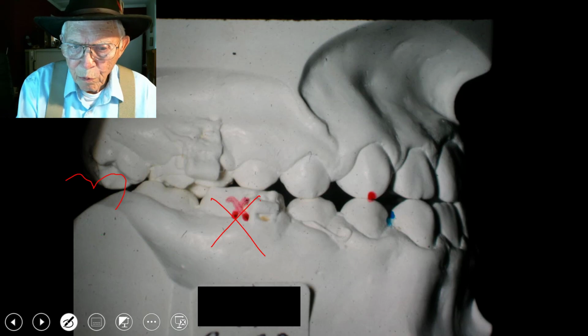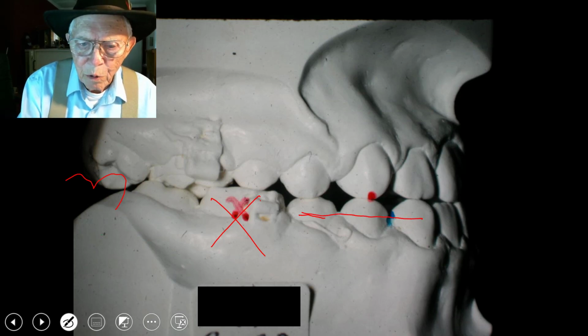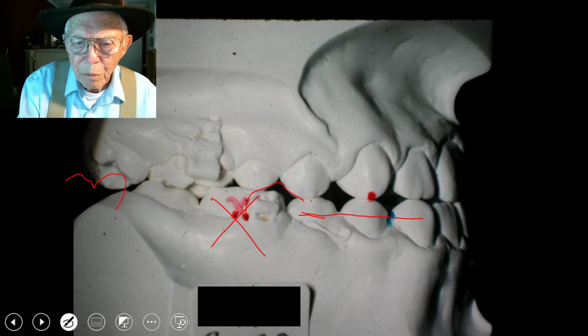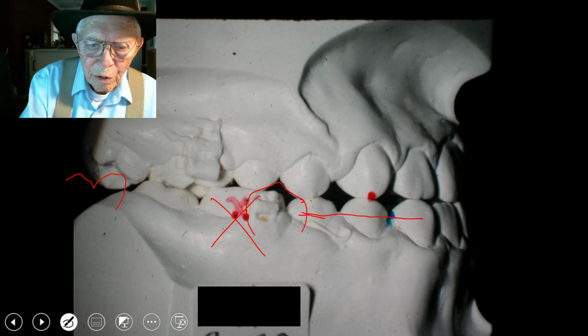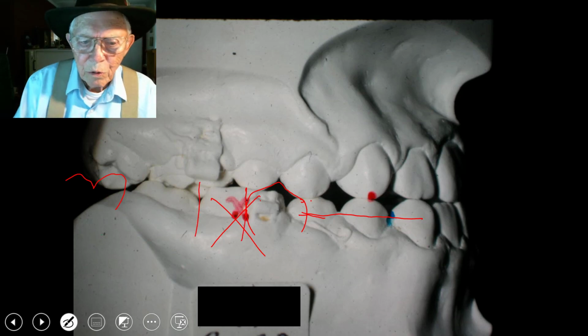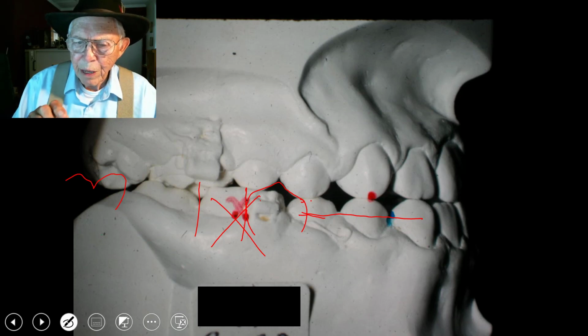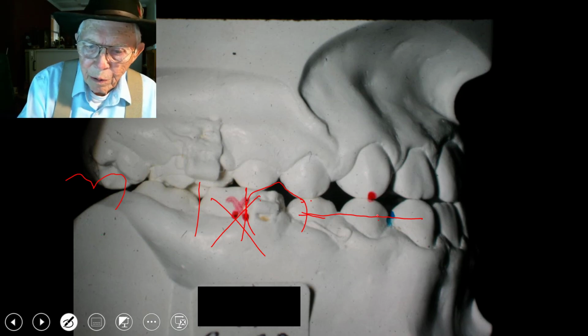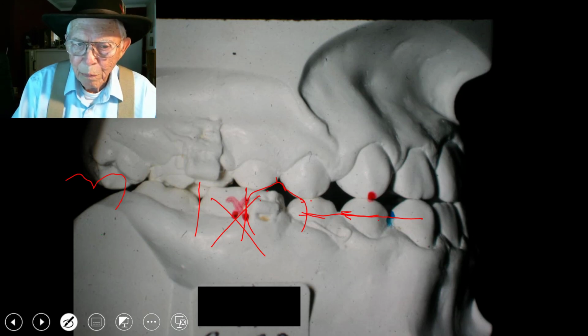Now here, in the process, we want to move this portion of the lower jaw back to where this bicuspid is fitting right in here, something like that. And now we've got this much of this space left here. So to start off with, from day one, we're going to be pulling this back and watching it. When it gets close to Class 1, we're going to slow up on that.